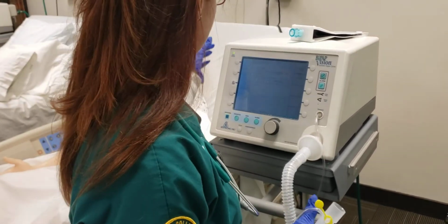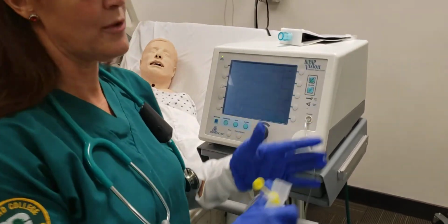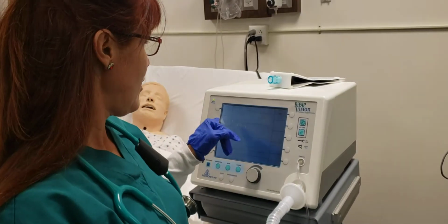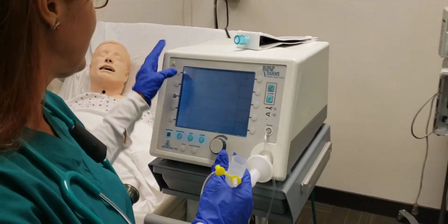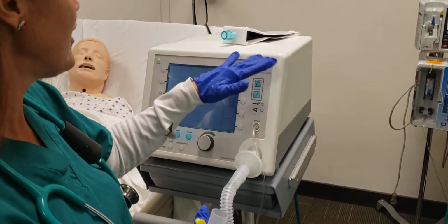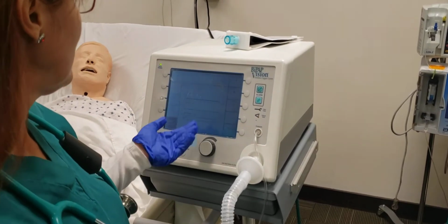All right, so now the test has been completed, so we're going to go ahead and set. We're supposed to put the patient on 5 centimeters of water pressure, CPAP. So we set that to 5. So then we go over here and it's 100% FiO2. It's already on that. Next we go to our alarms.